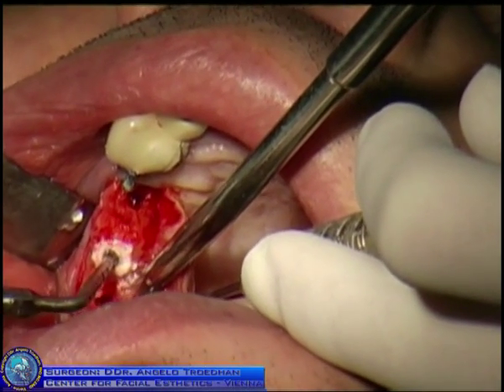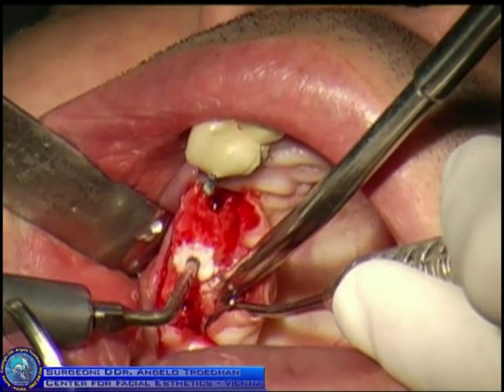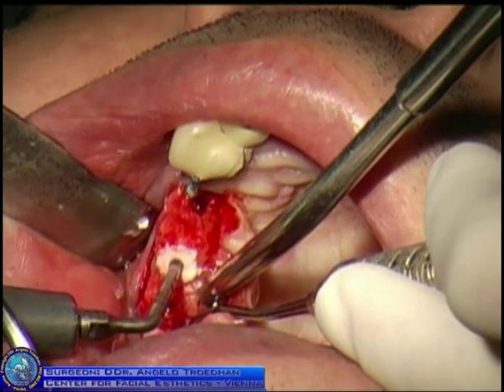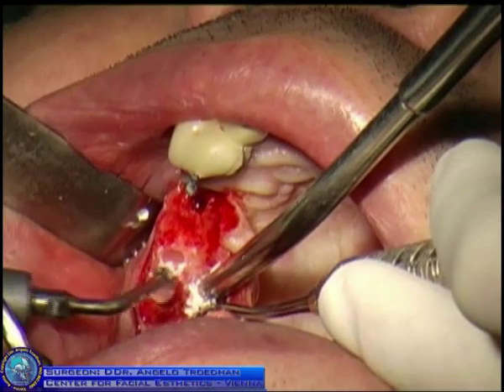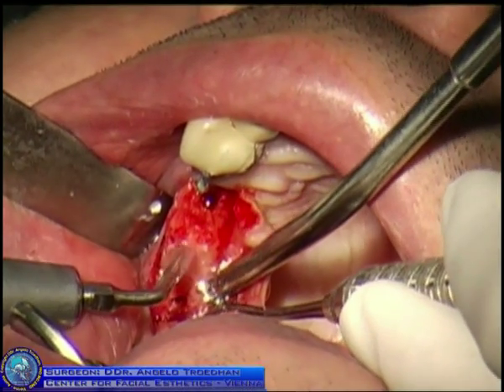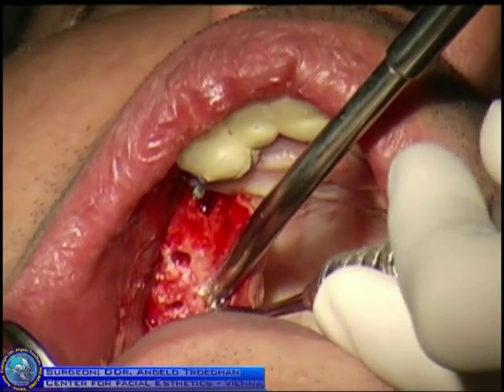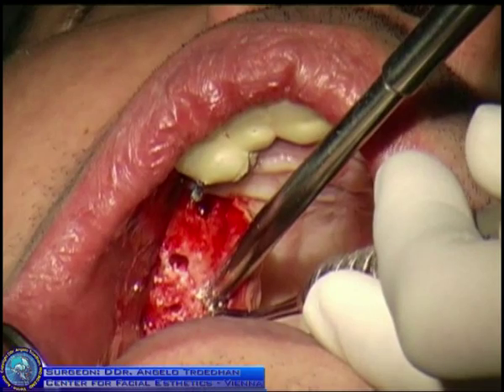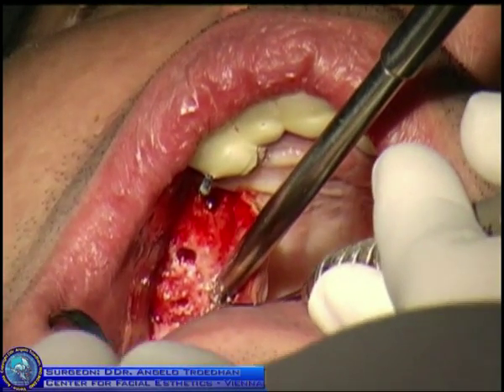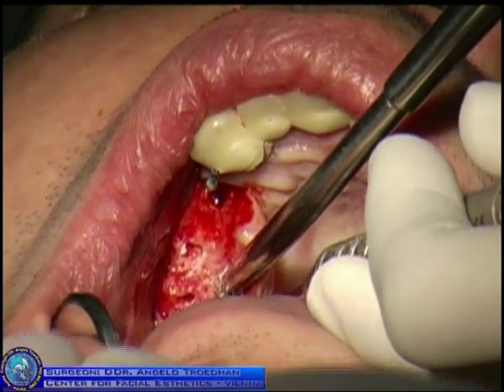Plug because we insert the trumpet once again. And then we activate it for about 2 or 3 seconds. One Mississippi, two Mississippi, okay? And you see there is only very, very little loss of material. And the entire water comes out again, that means the sinus membrane is proof. So we proceed with plugging.